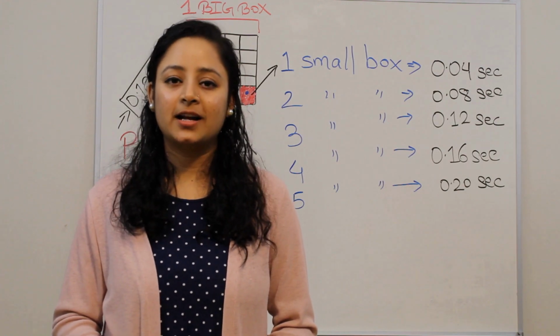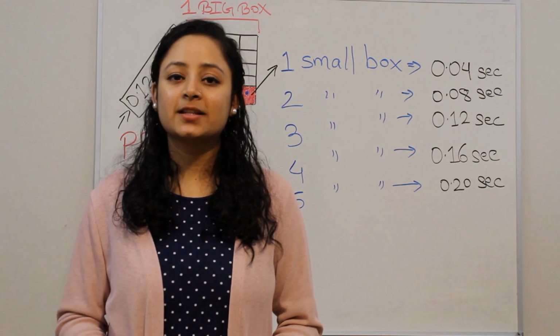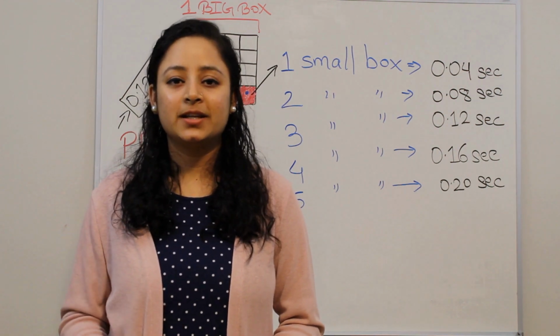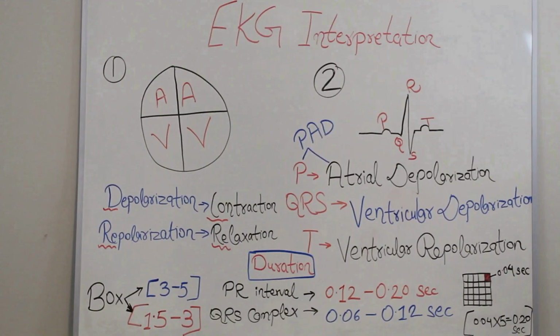I am Namna Kharal, and in this video I would like to share some important concepts on the basics of electrocardiogram, including some important points for atrial fibrillation and ventricular fibrillation. So let's begin with the definition of electrocardiogram or EKG.